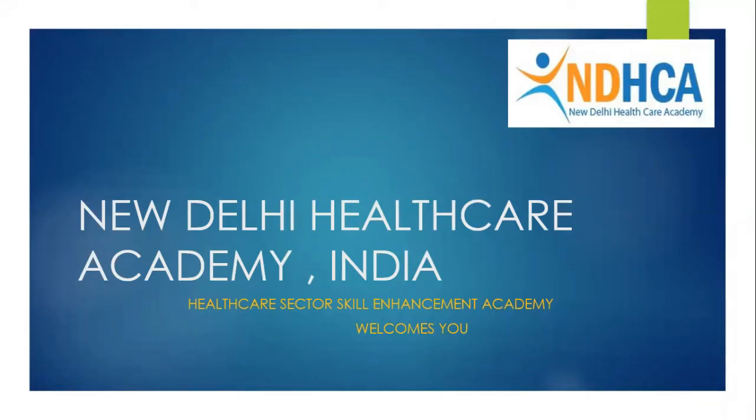We have been into healthcare teaching since 2010, and today we are beginning with our first class on basics, that is the ultrasound imaging of normal gynecology anatomy for 1 hour. After that, we are going to talk on ultrasound imaging of normal gallbladder and cholelithiasis. There are a lot of participants who are already enrolled with us and have already attended our class on physics.